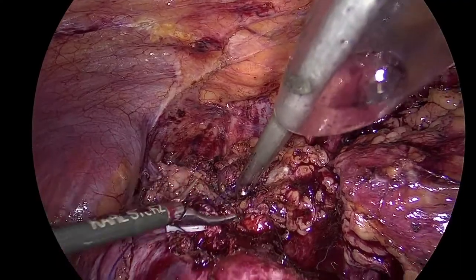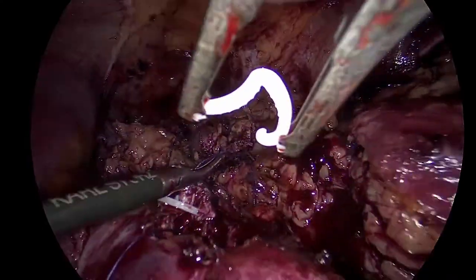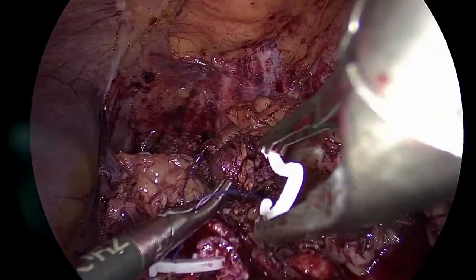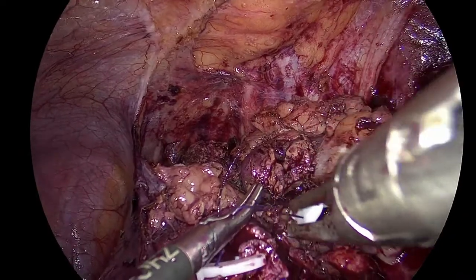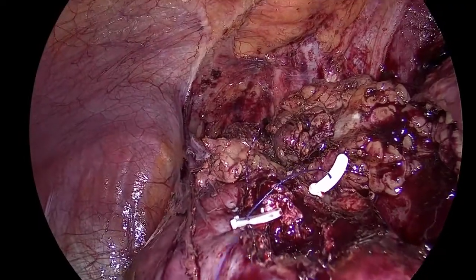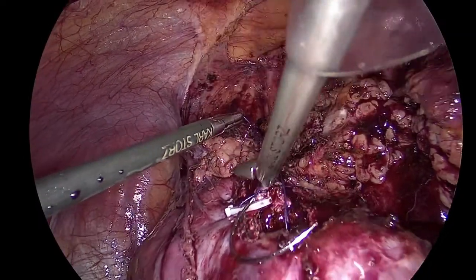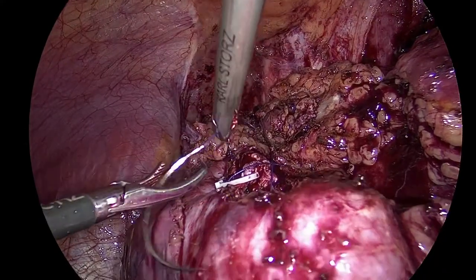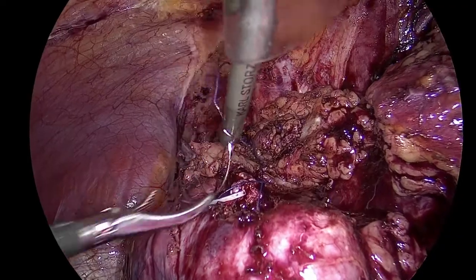Clip. So we put a clip on, clip on both sides, so there's no tearing of the parenchyma on the capsule. Good. Give me a needle holder. Good. One or two more sutures, I think we're done. Now, I don't think I will put any bolsters. We stopped doing this lately.